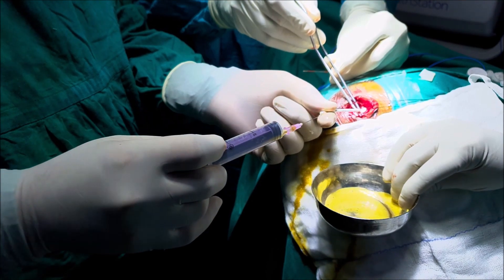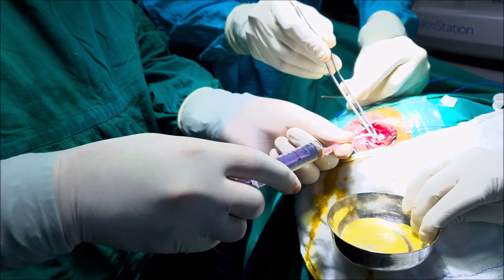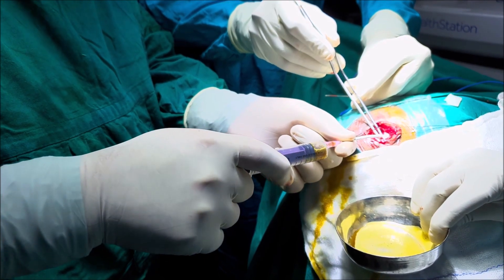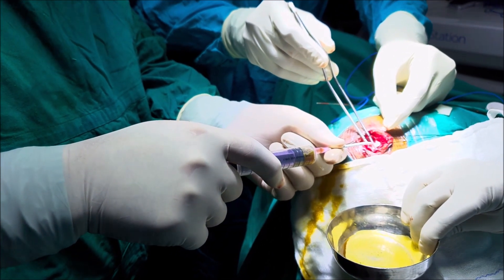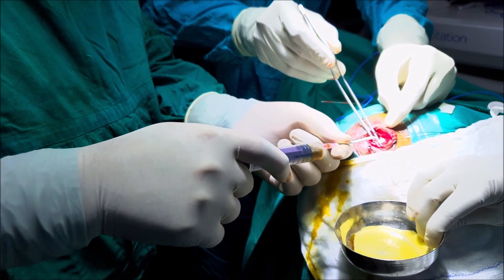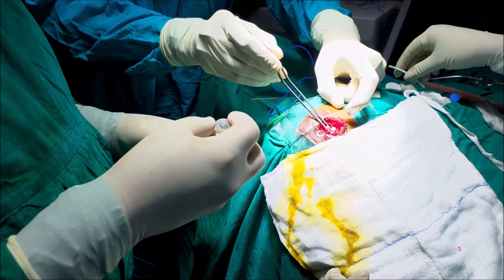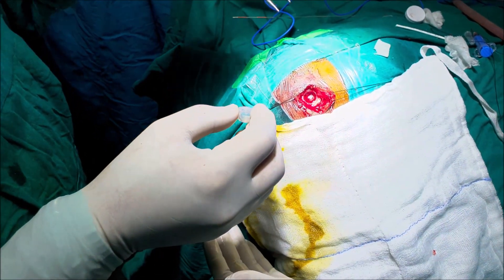Once the last 5 to 10 ml of fluid is aspirated and it stops coming, we should not use force to draw the fluid. That may cause a suction effect on the capsule and may lead to extra-capsular hemorrhage outside the capsule, which is beyond our reach and not good for the patient. So once aspiration is complete, the excess tube is cut and the reservoir is connected to the cyst catheter.